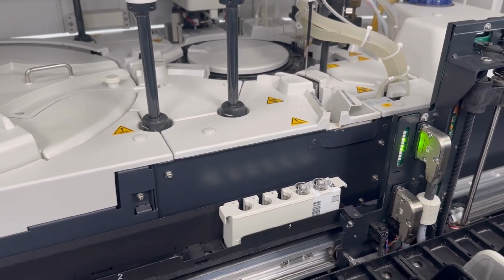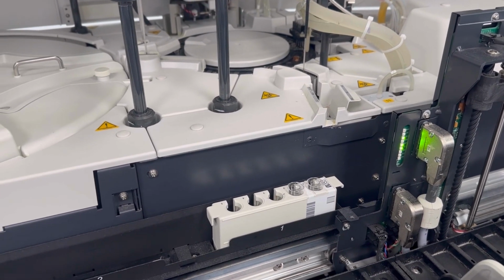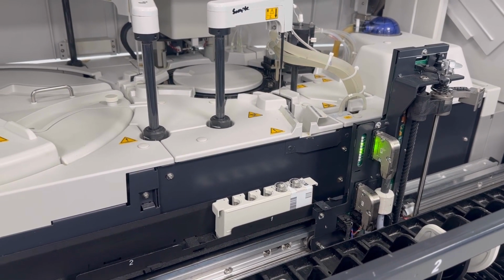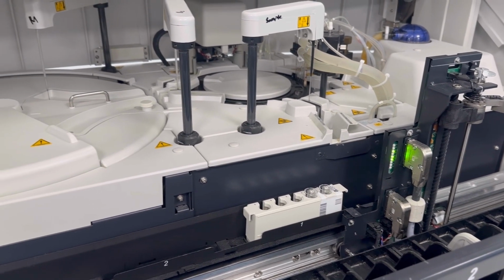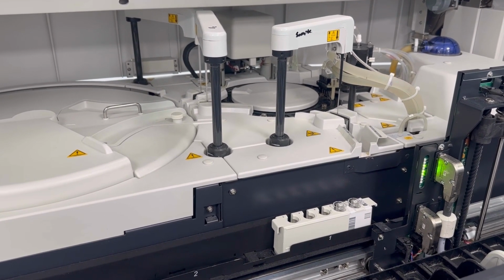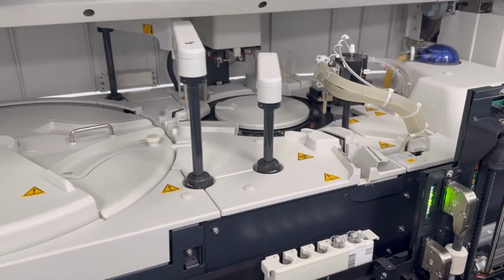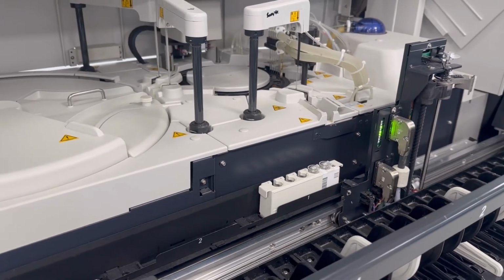This is how the machine will take the samples, and this is how the machine will operate the samples with the specific reagents which we have already ordered on the system. This is the R1 probe, this is the R2 probe, and this is the sample probe. So if the machine wants sample, it will take the sample from the sample probe. So we have three different kinds of probes in the biochemistry to process the sample.